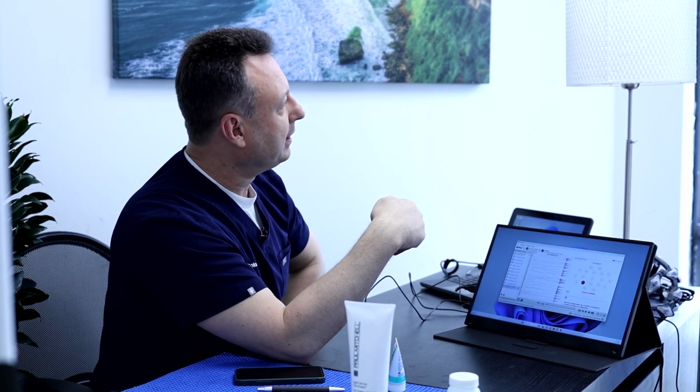Okay. We want to compare it to the previous one. Now, for Dima's sake, we're not going to discuss anything here, any private information. We're not going to show anything in terms of diagnosis or any kind of clinical findings, but I just want you to have an idea of what we're going to be looking at. We're not interested in doing EEG to determine abnormalities, what the neurologist would be looking for. We are actually looking at the baseline brain activity, which is inherent to the brain.